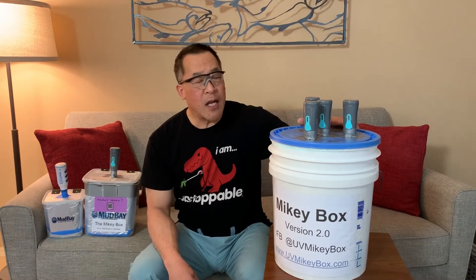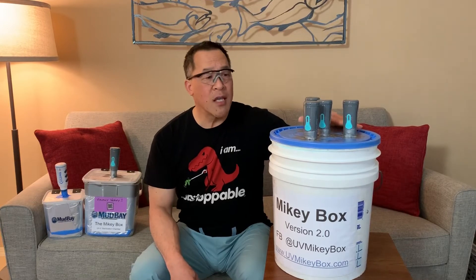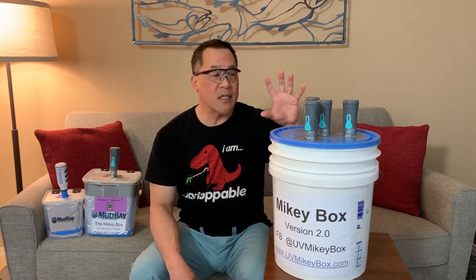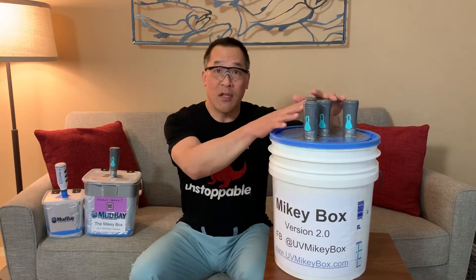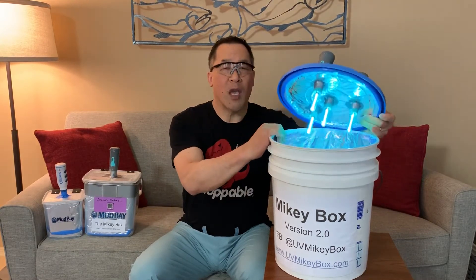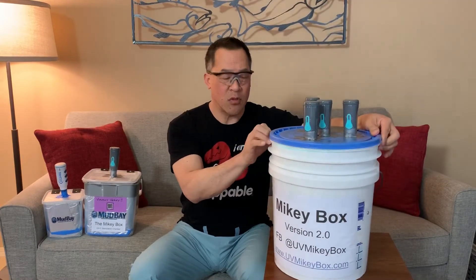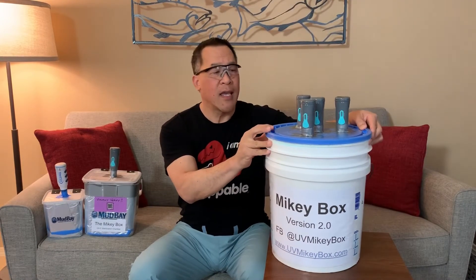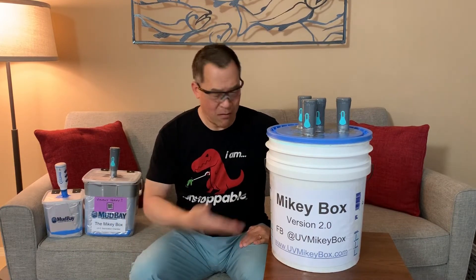The cost — the unit production for this is about $240. Everything on this is accessible from the average household except for the SteriPens. You have aluminum foil, you have duct tape, you have clear packing tape and cardboard. That's it — oh, and a bucket.